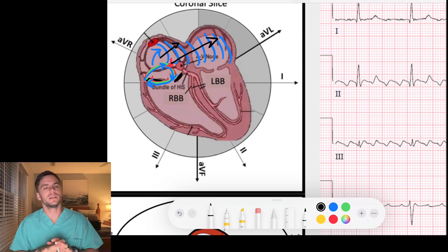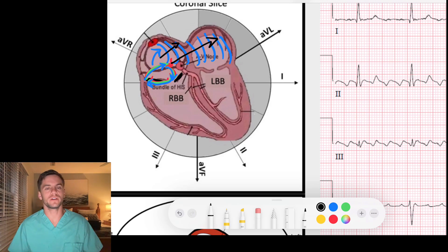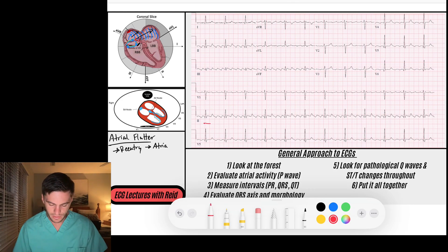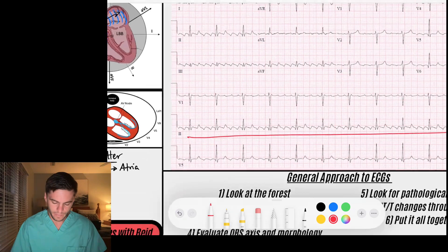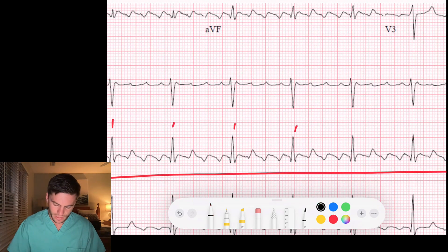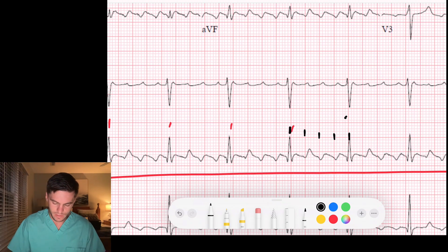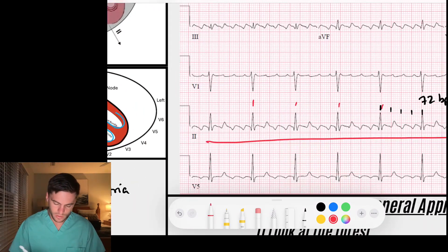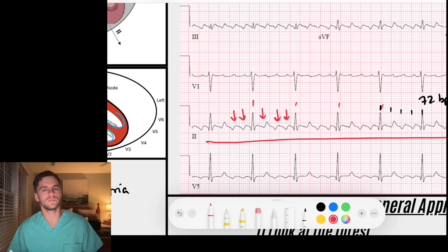That is the basic concept of the re-entry circuit within atrial flutter. Now let's talk about what happens to the rest of the rhythm. When I look at this EKG, I scan through and notice a regular rhythm occurring at a rate of about 72 beats per minute. I look for P waves and notice there's a baseline pattern — there's not really a distinct sinus P wave before the QRS complexes.